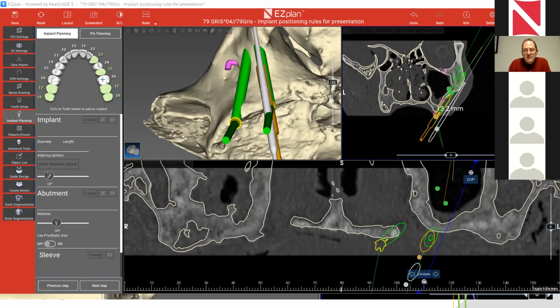With the Zygomatic, just to give you some more information. For instance, if you go to a quad zygoma with 2 pterygoids and let's say 2 laterals, you can finish the whole procedure, from the minute you started cutting the flap until you've put the last multi-unit in the mouth, within an hour.